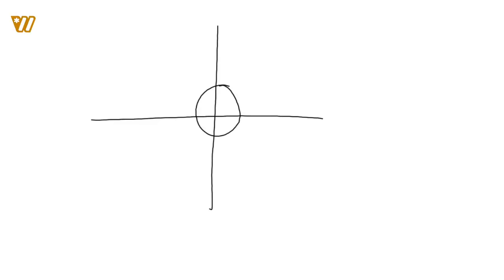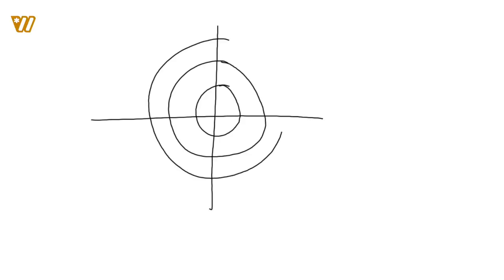Remember, whenever you're looking through a lensometer, there's a couple things you're going to see. One of them is a tic-tac-toe pattern, your vertical and horizontal lines, 3 of them being wider, 3 of them being thinner. A lot of times that's going to be green. It could also be white depending on your lensometer. The other thing you're going to see is your bullseye, 3 circles. So there's your bullseye pattern.